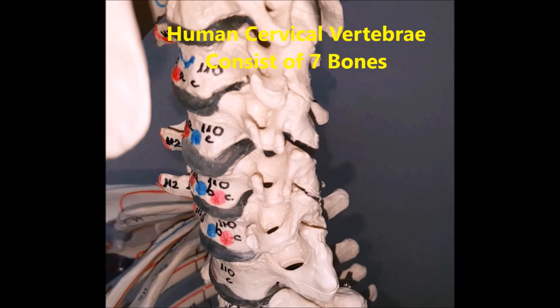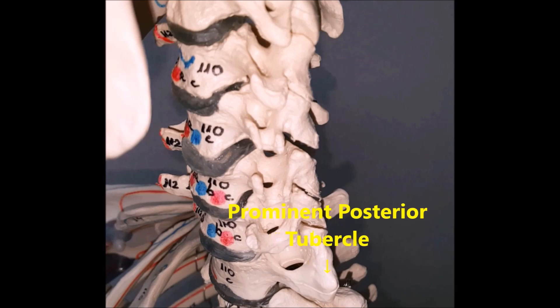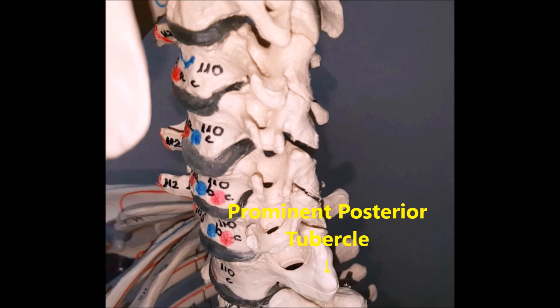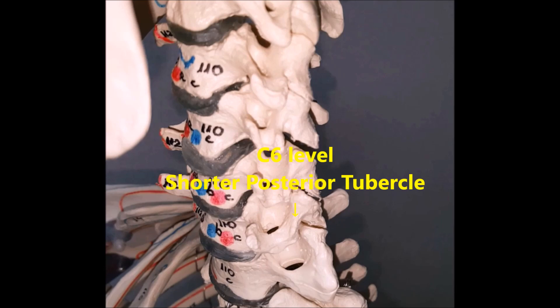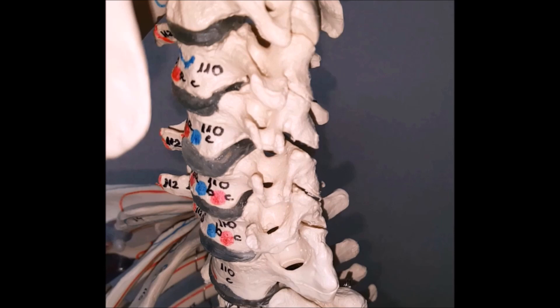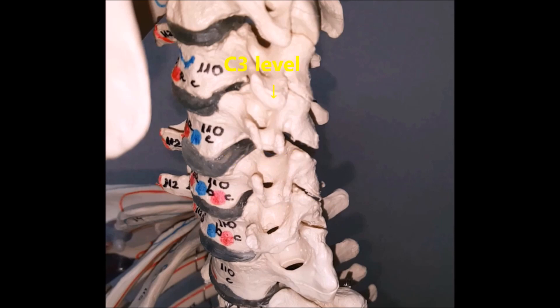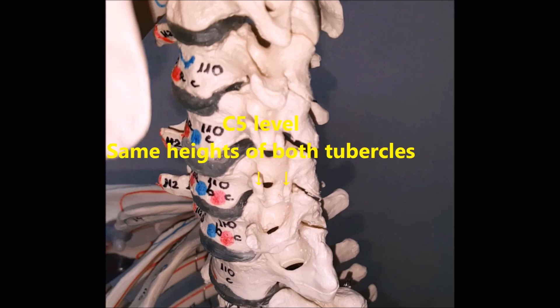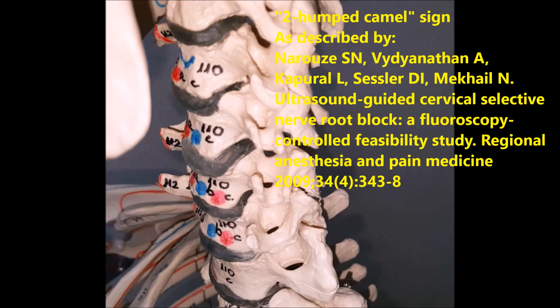The human cervical vertebra consists of seven bones. The C7 level is marked by a prominent posterior tubercle but a rudimentary anterior tubercle. The C6 level has a relatively shorter posterior tubercle compared to a much taller anterior tubercle. The C5, C4, and C3 levels have similar heights of anterior and posterior tubercles, making the two-humped camel sign as seen on musculoskeletal ultrasound images.